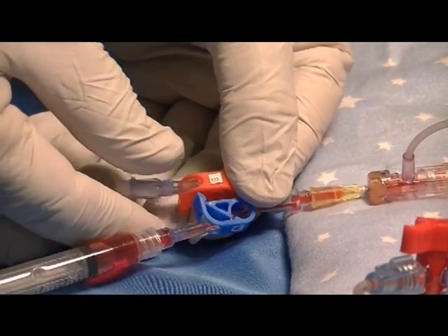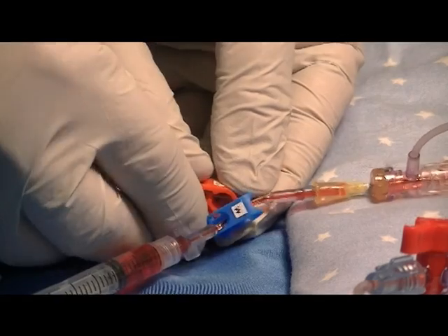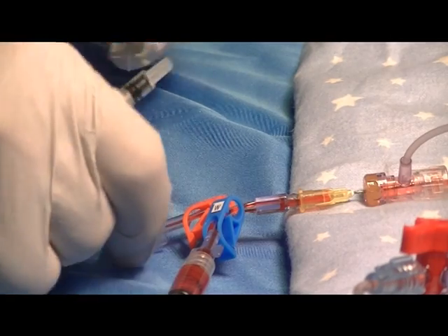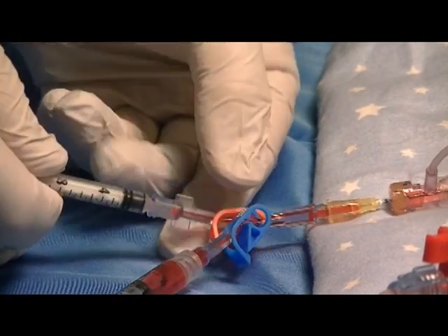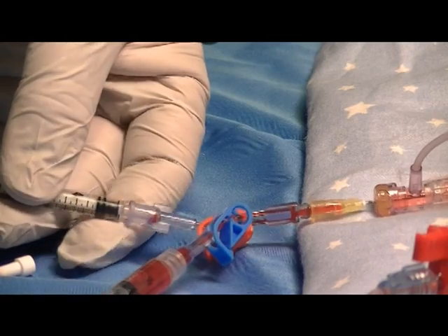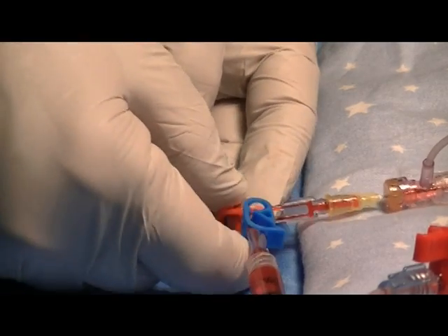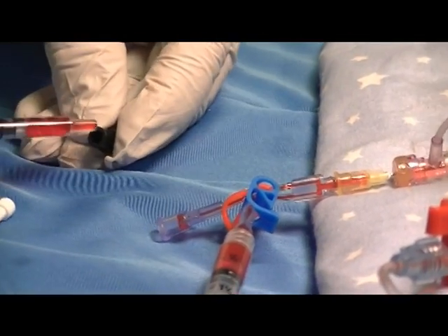Next, unclamp the sample side clamp and allow blood to come back to the white vent plug. Clamp that back and attach the 1 ml blood gas syringe to the sample side. Unclamp and draw the desired volume of blood into the syringe. Re-clamp and remove the sample syringe cap and send it for testing.